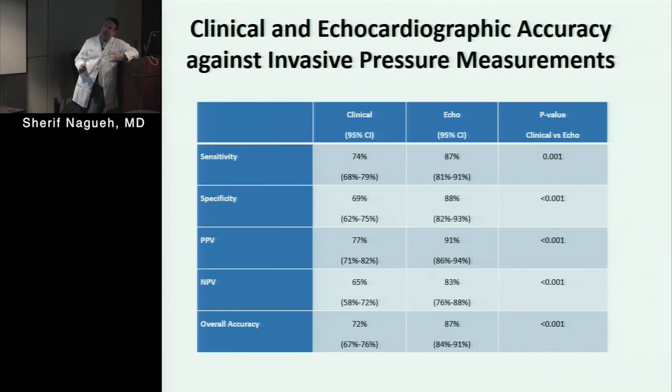Yeah, well, yeah. By the way, this has been done before in some of the early studies, for example, validating BNP measurements and comparing it with clinical data. That was done before. No BNP? No, if it were obtained, it was looked at, yes. And we have it in roughly 100-some patients. It helps the sensitivity, but it drops the specificity, particularly with depressed EF.